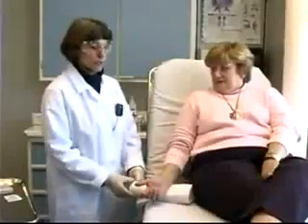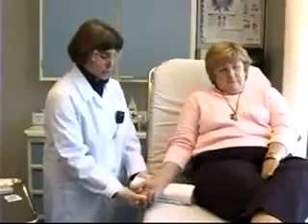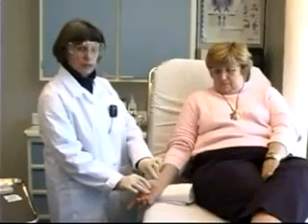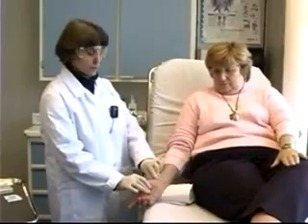I now have my patient seated comfortably on the stretcher. I'm going to tuck a rolled-up towel underneath her wrist. That will help hyperextend the wrist a little bit, which will bring the artery a little closer to the surface and make it a little easier for me to palpate that artery.